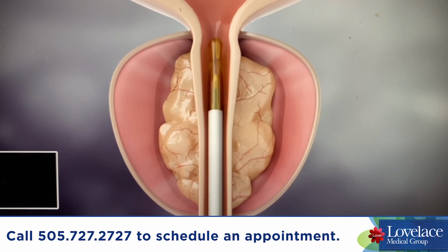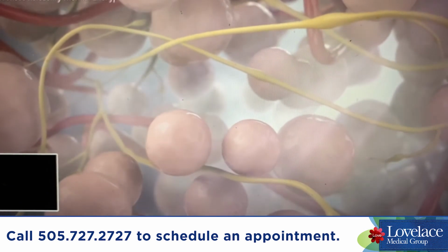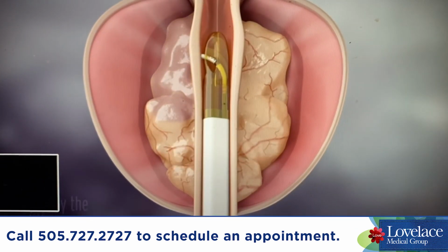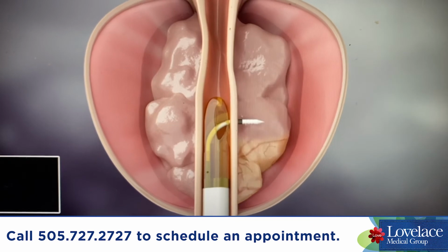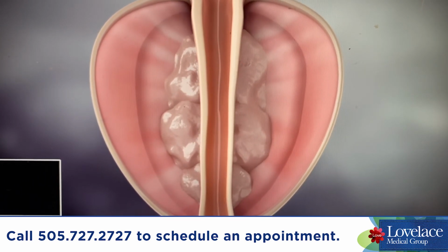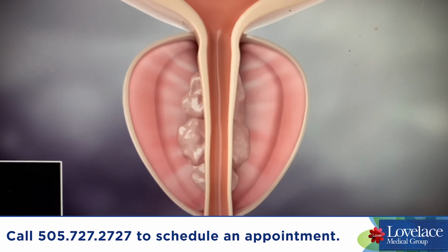Each 9-second treatment uses 0.42 milliliters of radiofrequency heated sterile water vapor, which rapidly and uniformly disperses through the tissue interstices. The condensation of water vapor releases stored thermal energy. Cell membranes are gently denatured, thereby causing immediate cell death. The vasculature is closed, and there is denervation of the alpha-adrenergic nerves within the treatment zone, providing an efficient, uniform, predictable treatment. Over time, this ablated tissue is resorbed by the body's natural healing response, reducing the volume of tissue, allowing the urethra to open, relieving lower urinary tract symptoms.